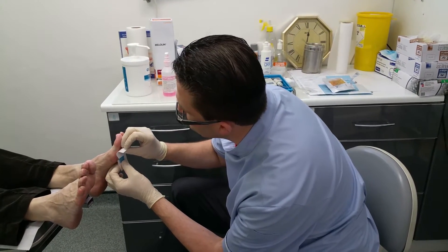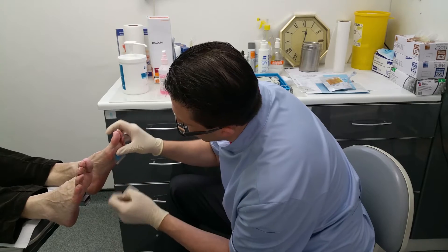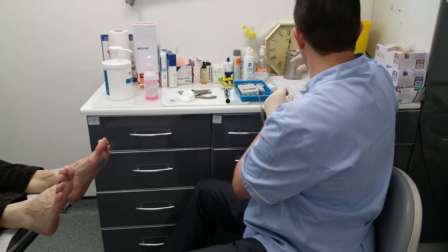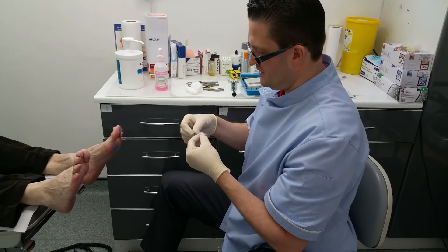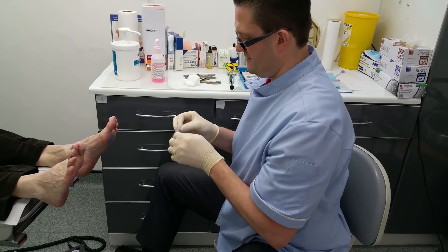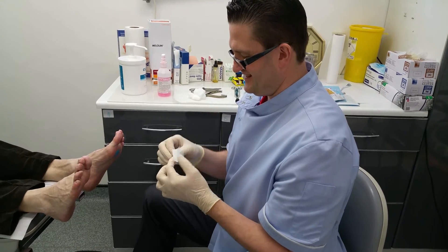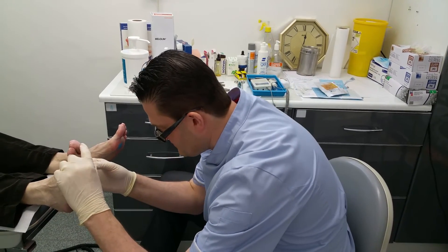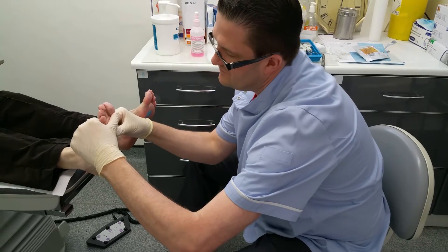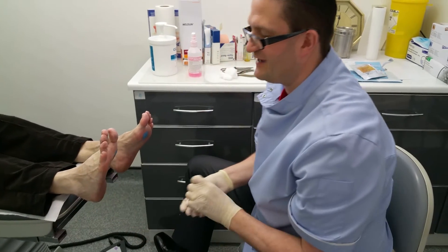You're not allergic to plasters or anything? It's all sealed in there, so the only moisture that's going to come from anywhere is from your skin. This has to stay on for 10 minutes, so we'll see what happens over the course of 10 minutes. Ideally you don't put them on when you've just had a shower or bath or just been for a run. We're going to leave those there and come back in about 10 minutes.